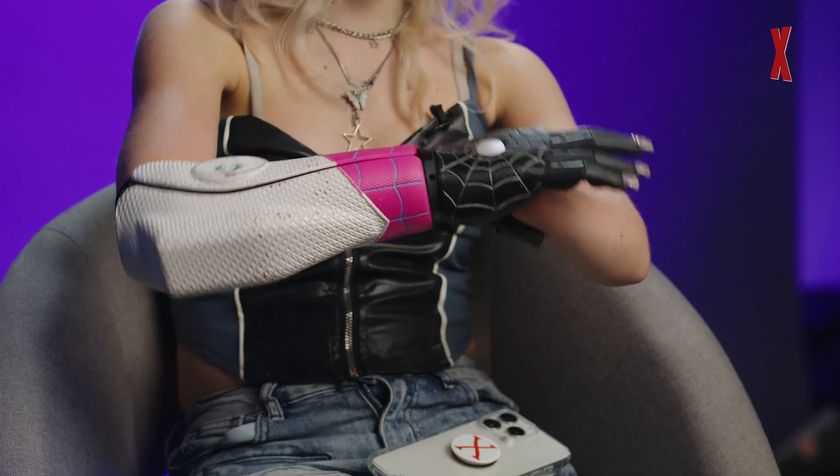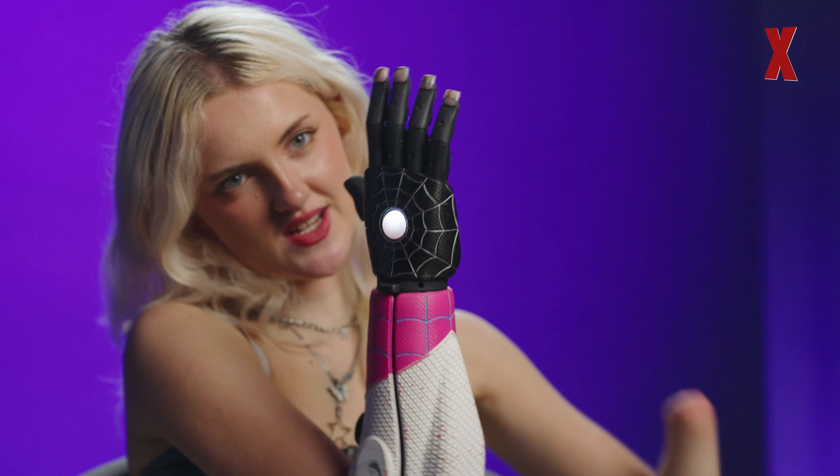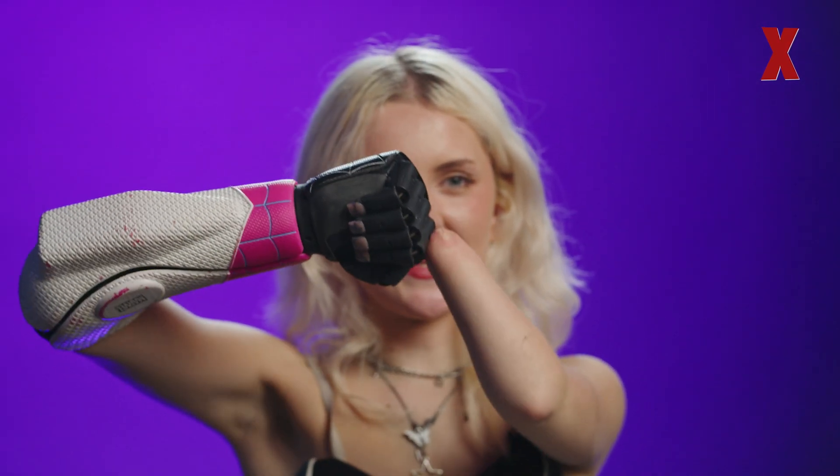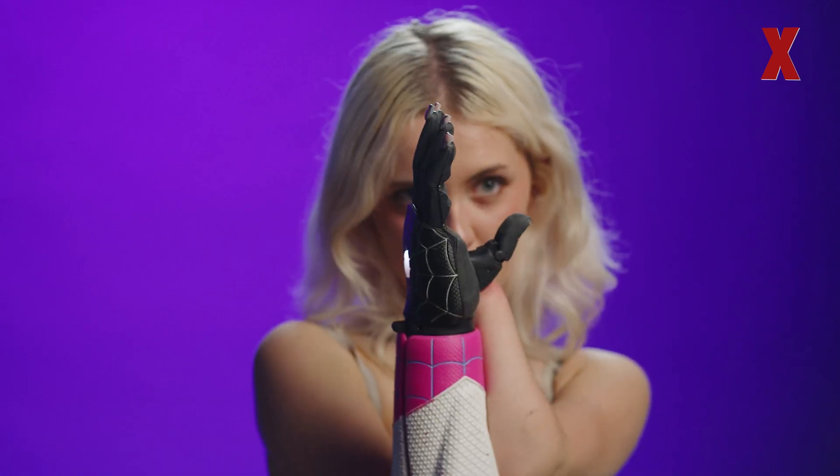This is the Hero Arm by Open Bionics, and it's what all these arms — bar the first one — were leading to. We've now got Iron Man cases, Spider-Man cases, Elsa from Frozen cases — loads of fun options. They're all muscle-operated like the other arms, and the sensors are in here. If I squeeze my muscles it will close; if I flex it'll open. Then if I flex again you'll see the button on the back flash green and the thumb comes around — that's me changing the grip mode. Those two sensors control the entire hand.